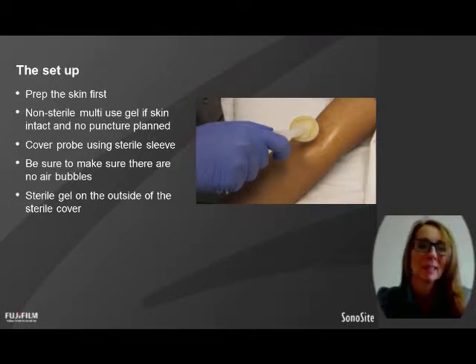And be prepared. Prep the skin first if you're going to cannulate, and then you want to have a look. Even if you're maybe not going to use it to guide your cannulation, prep your skin, because if you then decide to go ahead and use it to guide your cannulation, if you've used your sterile probe cover on non-prepped skin, you'll have to change your probe cover.